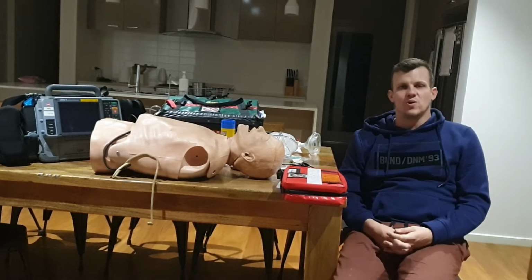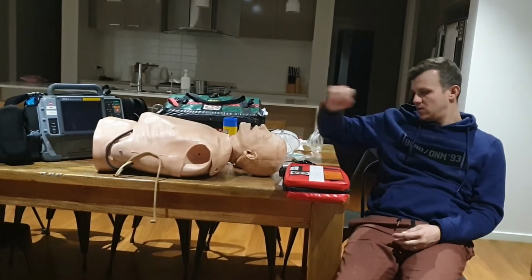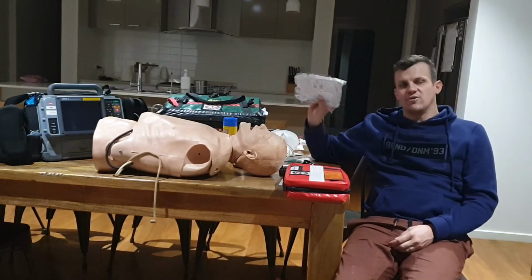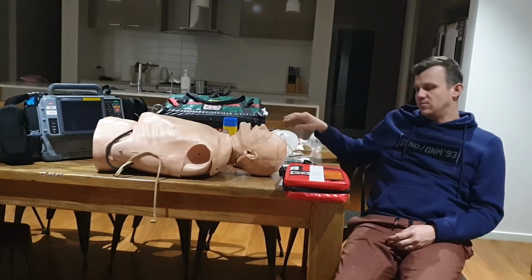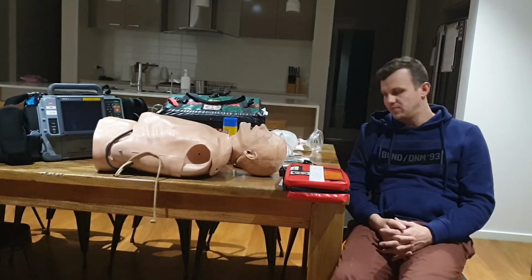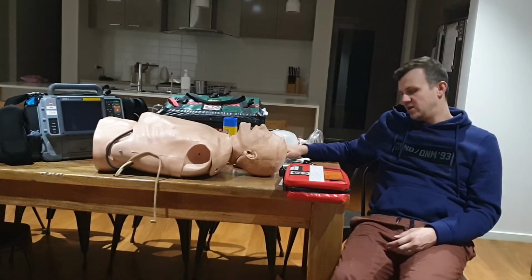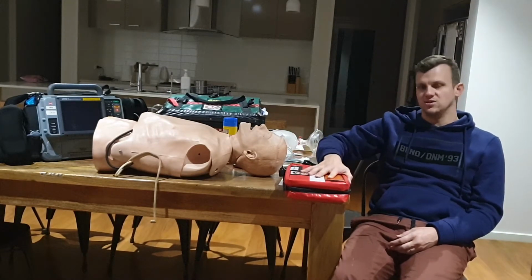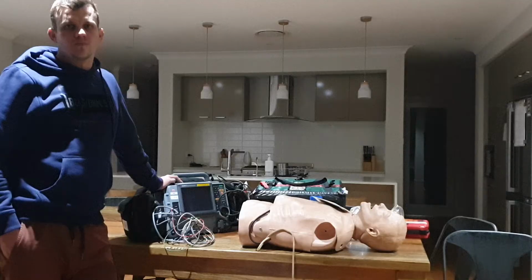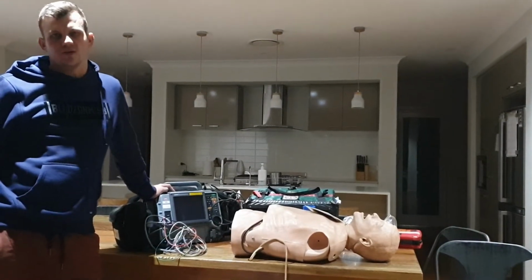So the equipment you'll require to do this procedure would be your LifePak 15, your multifunction adult defib pads. You want to have some advanced airway equipment and some oxygen therapy, so you want to have your BVM, some oxygen masks. You want to make sure you've got some suction equipment ready as well, and some sedation agents for the procedure. Now we're just going to go through the synchronized cardioversion procedure itself.